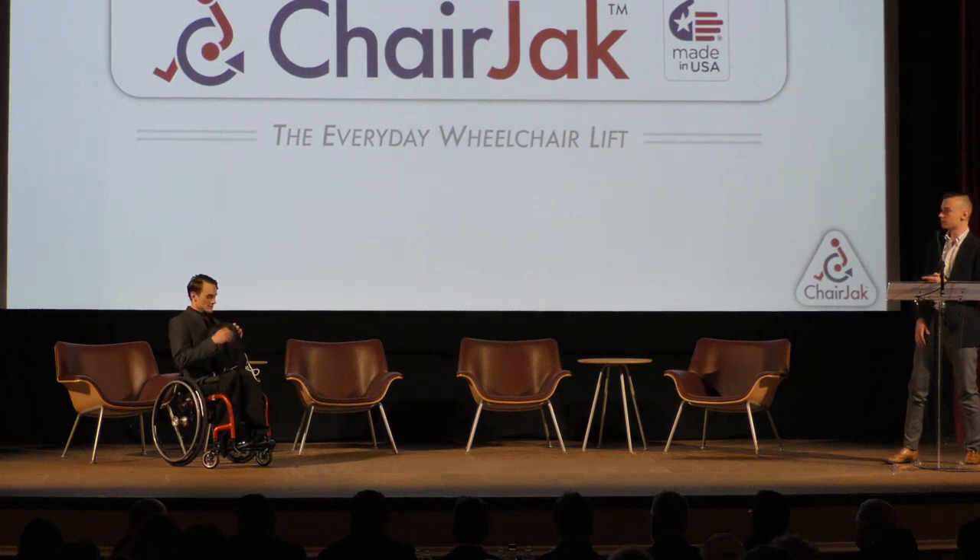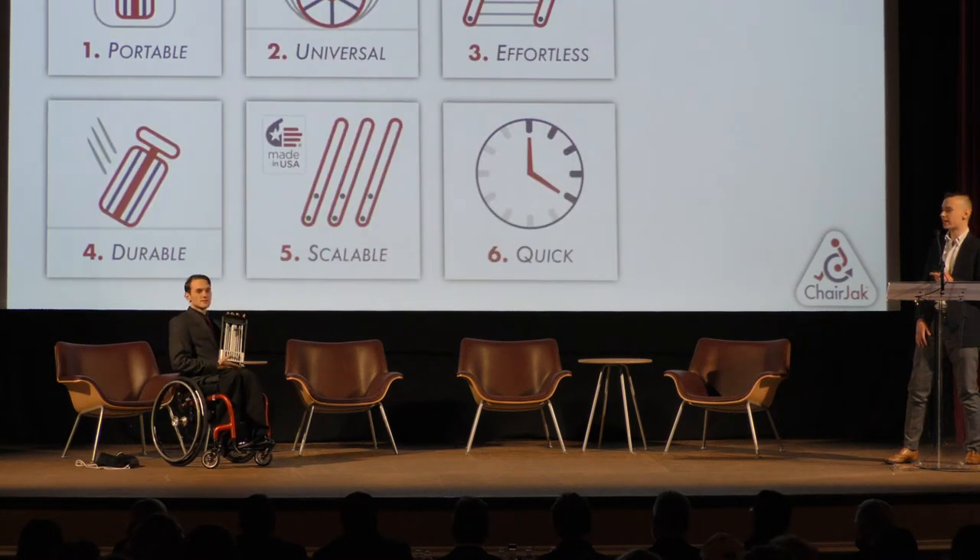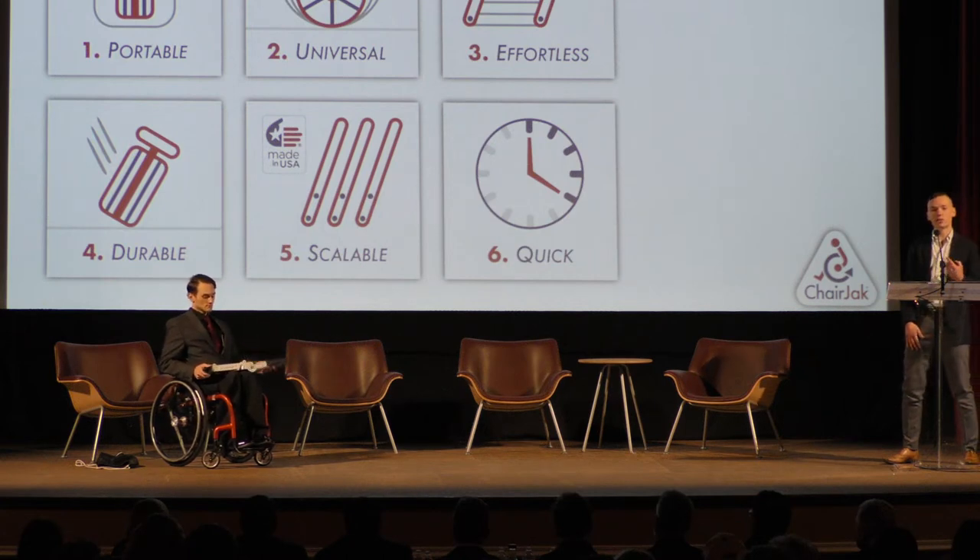The moment of truth, everybody. So now we see Jacob taking Chair Jack out of a standard drawstring bag. Small, portable. Chair Jack is portable. It weighs 4.4 pounds. It is universal, so it works for any wheelchair wheel diameter, which means that it could work for kids or for adults. One Chair Jack for everyone.